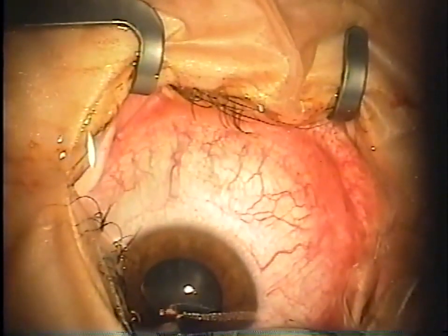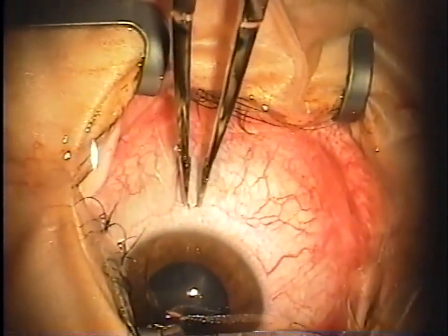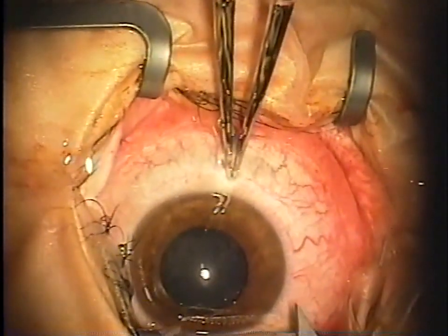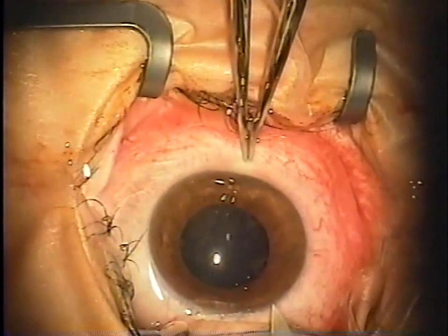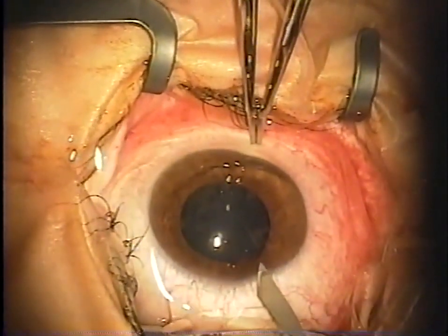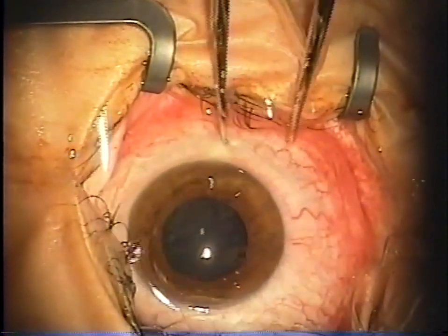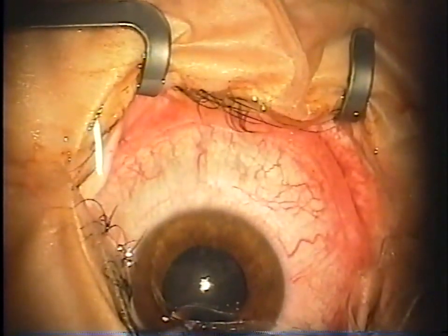I'm an ophthalmologist at Care Specialists in Clarkston, Washington, and today I'm going to share with you my standard technique for implanting the Visian ICL. First, we start off by making a small paracentesis. This, of course, is after the patient's already been sterilely prepped and draped and some topical medication was given for surface anesthesia.